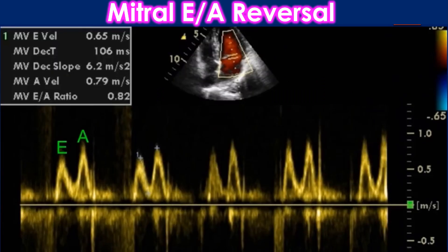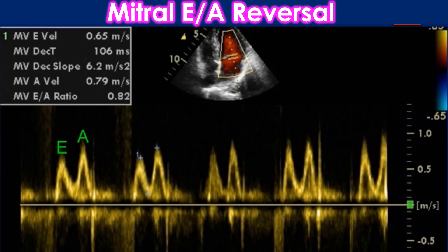Conventional Doppler assessment of transmitral flow showing E by A reversal in left ventricular diastolic dysfunction. MVE — Early Mitral Inflow Velocity; MVECT — Deceleration time of early mitral inflow velocity; MVE slope — Deceleration slope of mitral inflow velocity; MVA — Mitral inflow velocity during atrial systole; MVE by A ratio — Ratio between early mitral inflow velocity and atrial systolic mitral inflow velocity.